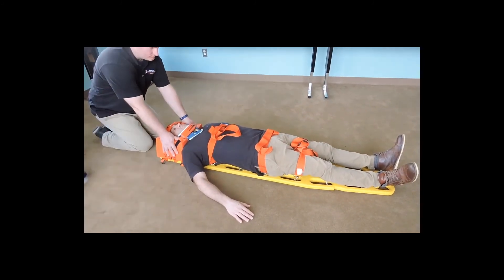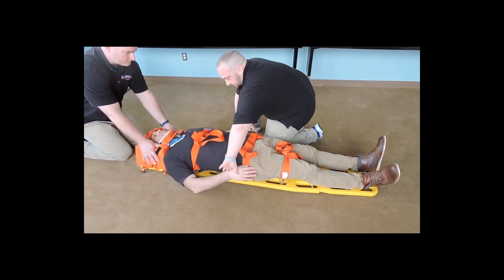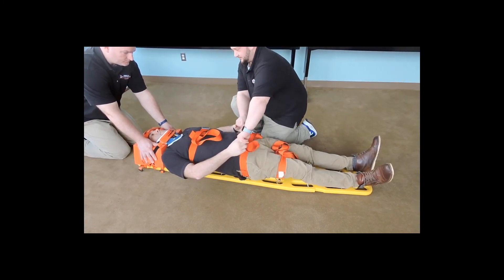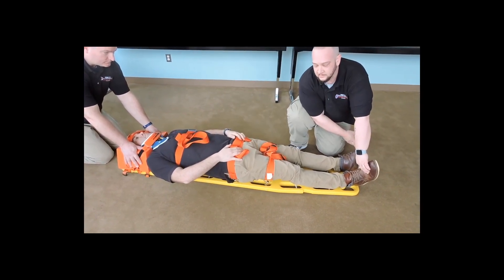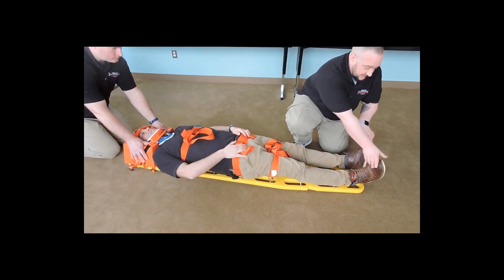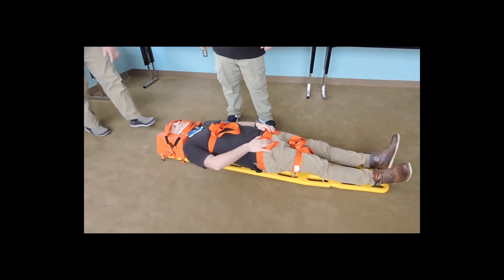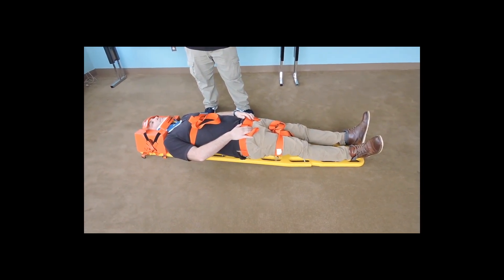Keep holding C-spine for me. I'm going to check one more time our CSMs. Checking for radial pulses, making sure they're present and equal. Can you feel me touching you? Same on both sides? Can you squeeze my hands? Pedal pulses again on bare skin — present and equal. Can you feel me touching you, sir? Same on both sides? Can you wiggle your toes? At this time I'll direct my partner to release C-spine. We would take our patient, immobilized on the longboard, transport to the hospital, and transfer care to an equal or higher healthcare provider.